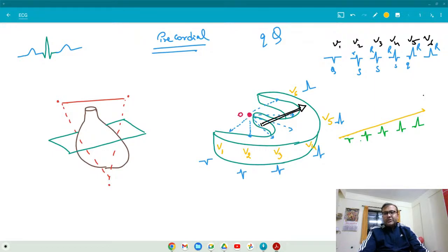Okay. So this is the idea of a functional ECG. This is how we check ECG. These are the concepts that we use in ECG. So let's talk about the P wave. What have we learned about the P wave? What should be the magnitude? How should it be present? Okay, we learned about the P wave.